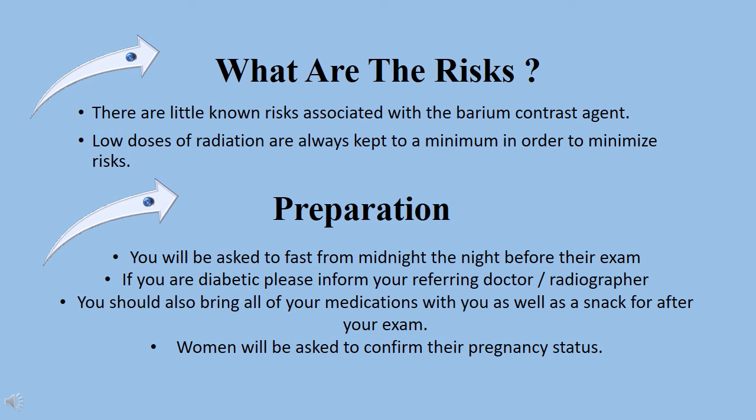There are little-known risks associated with the barium contrast agent. The agent is not absorbed by the body and simply passes through the digestive system. Exposure to radiation does carry risks. However, the exposure and time of the low radiation doses are always kept to a minimum in order to minimize these risks. You'll be asked to fast from midnight beforehand and avoid chewing gum.